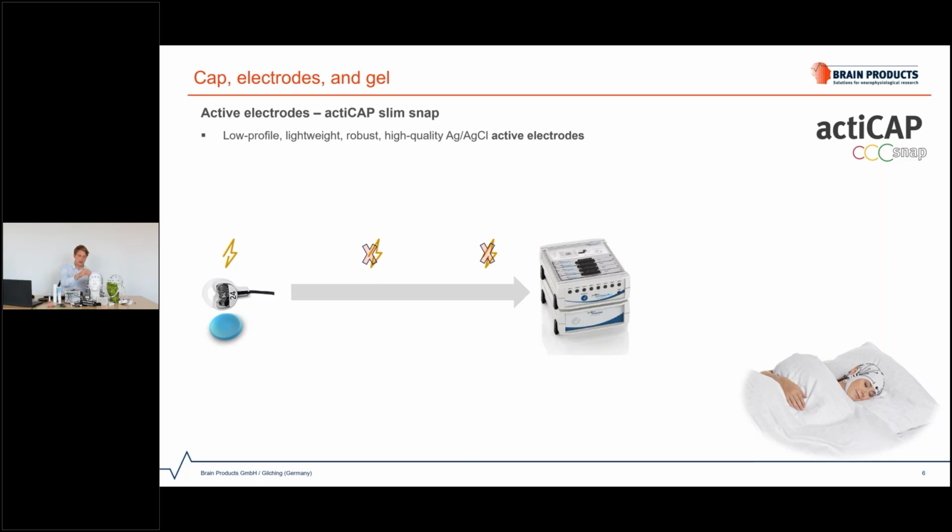It picks up the signal measured at scalp level and transfers it one-to-one to the amplifier, hence reducing to a greater extent the possibility for additional sources of noise, like cable movement or a noisy electrical environment, to spoil the signal while it travels along the cable.